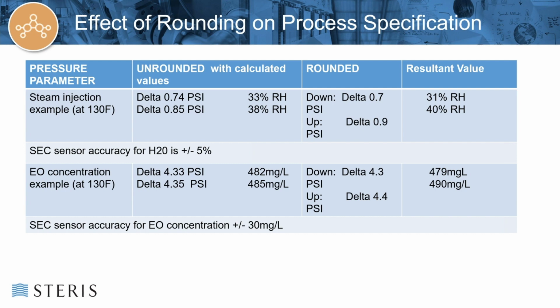So then another company said, oh, it's 50.0 plus or minus 5. So we're going to say 45 to 55. In reality, just drop the decimals. It's okay. If you round up 1 degree or down 1 degree, it's not going to make that much difference, especially if your tolerance is a span of 10.